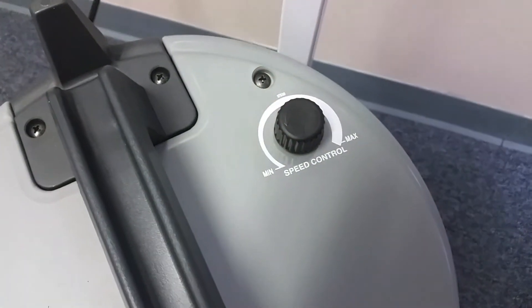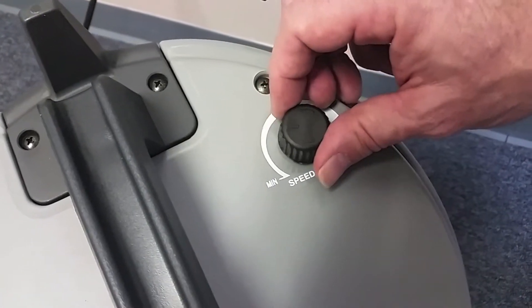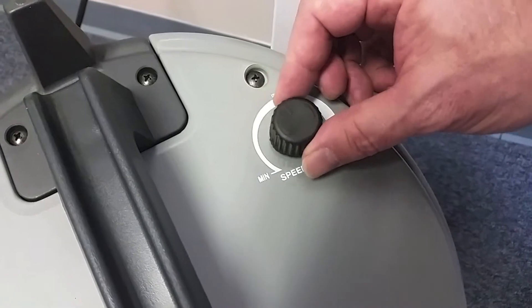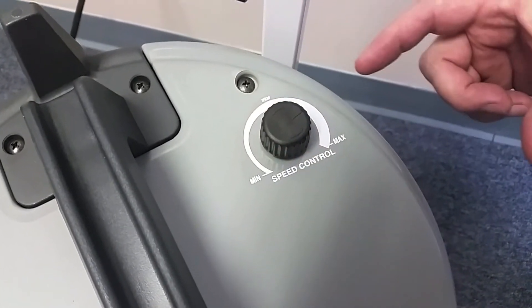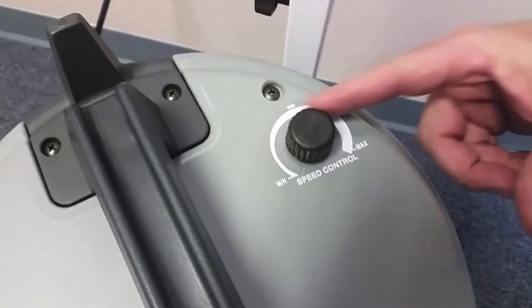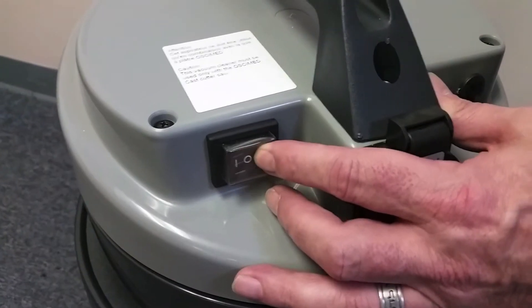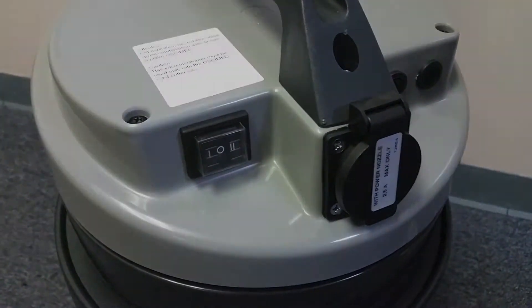The Osymed PSV has a variable speed motor knob that controls both vacuum sound levels and suction power with a single control. This feature works in either mode one or mode two operation.